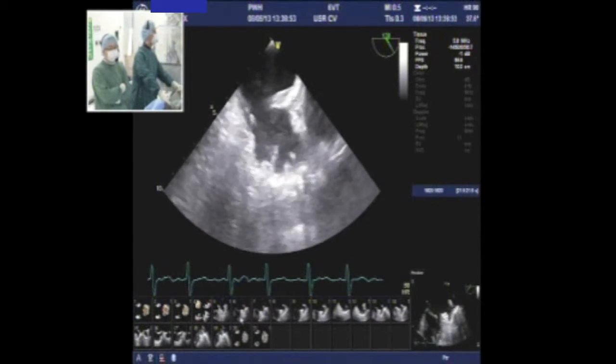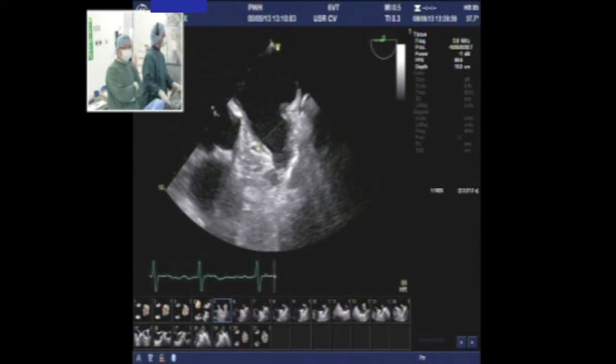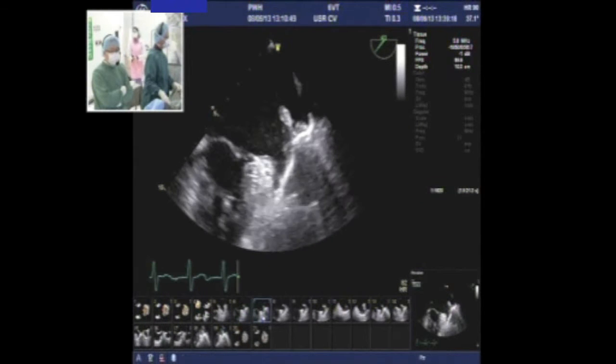Can you show us some of these measurements so we get an idea where you measured? Now, this is 0 degree. We measured from the circumflex to the other side. This is 21. I can't see the pulmonary ridge very clearly on this view, but the diameter at 0 degree is approximately 21. And this is 45 degree.